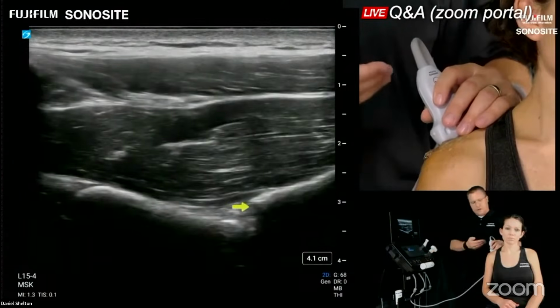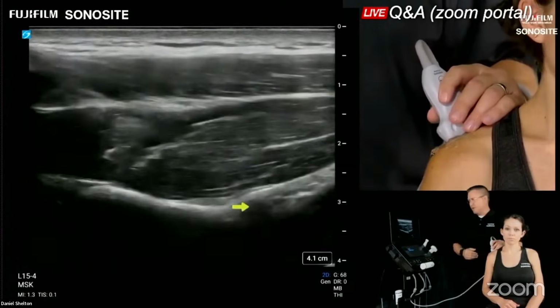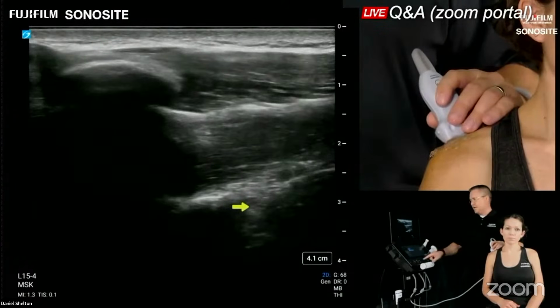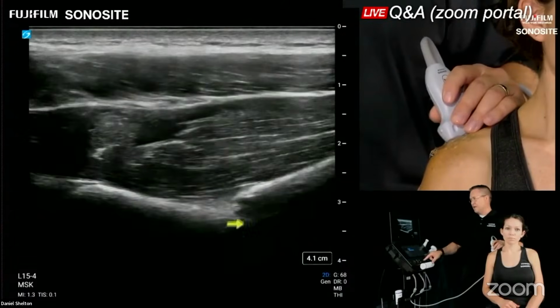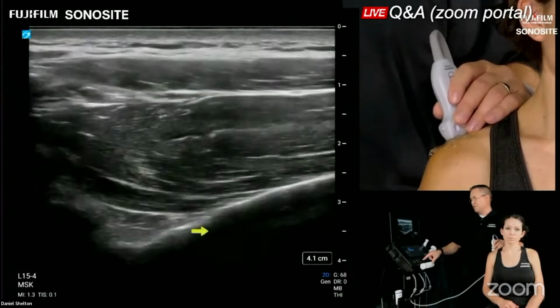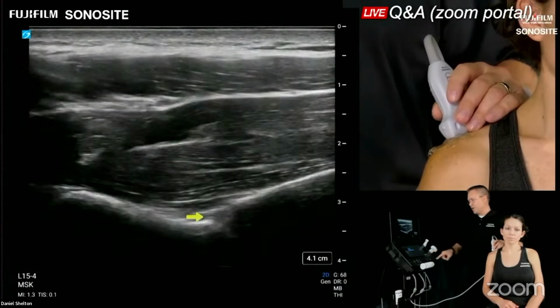And then what I'm going to do is aim the probe anteriorly, and then sweep it posteriorly. Anteriorly, we see it fall off because I'm just about at the coracoid process itself. Then I'm going to go posteriorly until I see that notch form in the fossa here. That's where we should see a little pulsatile artery, and we can check our work with the artery that follows the suprascapular nerve by throwing on our color power Doppler.